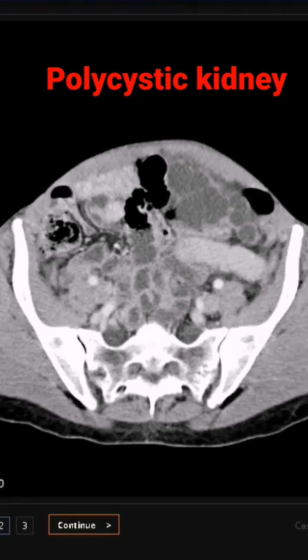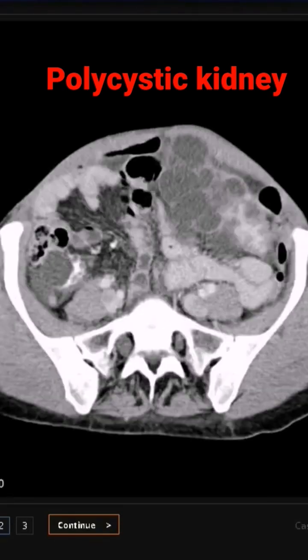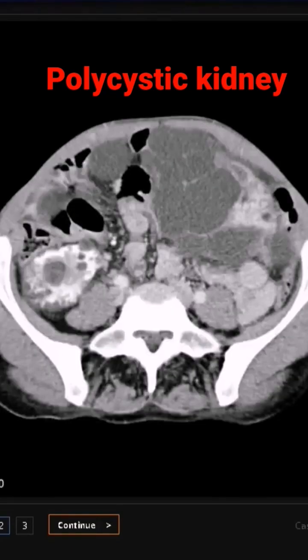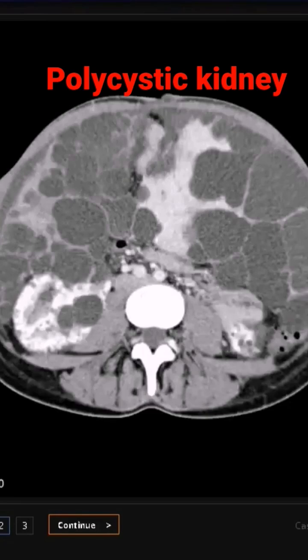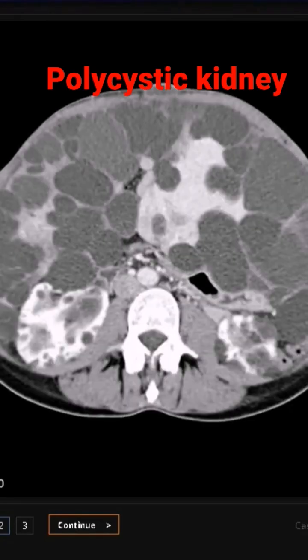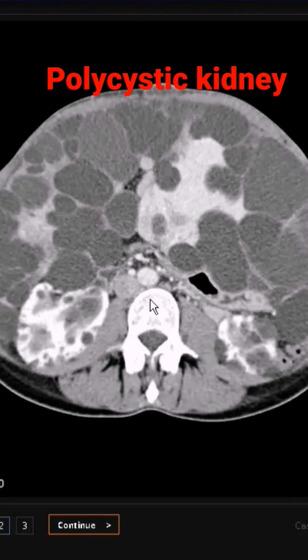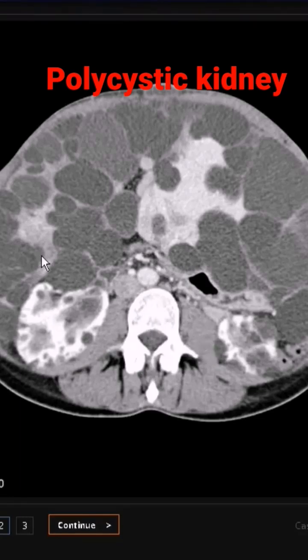A CT scan of a patient with polycystic kidney disease. This was a boy, and here you can nicely see the two kidneys — the one on the right and one on the left — whitish in color, with all the cysts forming them. In the center we have the vertebra and the muscles surrounding it, and there are so many cysts here. Multiple cysts are not only involving the kidneys but also the surrounding structures.